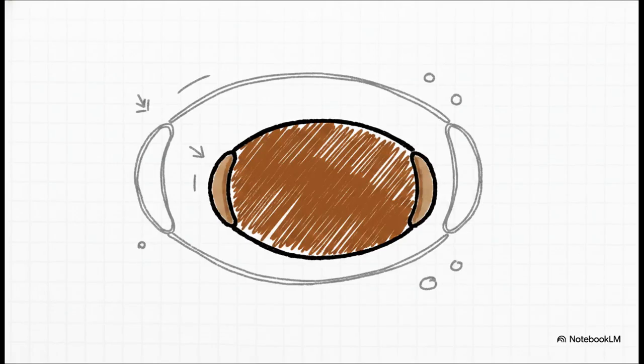Conversely, when you're looking at Capillaria, the shape is much more of a standard oval, not a barrel. It still has that brown coloration, but those polar plugs are notably intruded. They definitely don't protrude outward abruptly like the last ones. And critically, your reticle will confirm a smaller total length of just 50 micrometers.